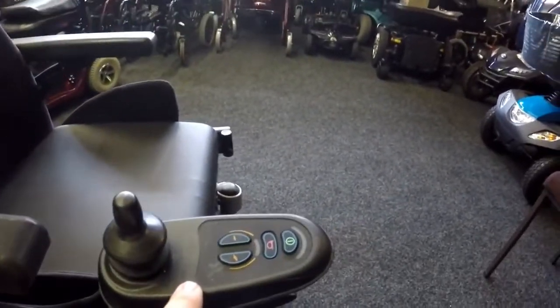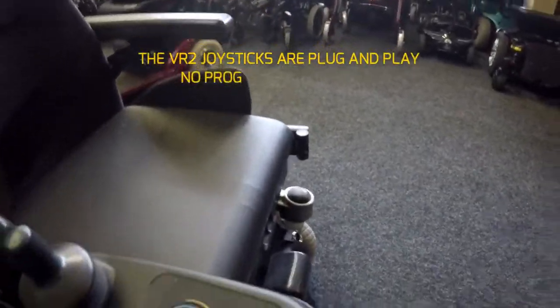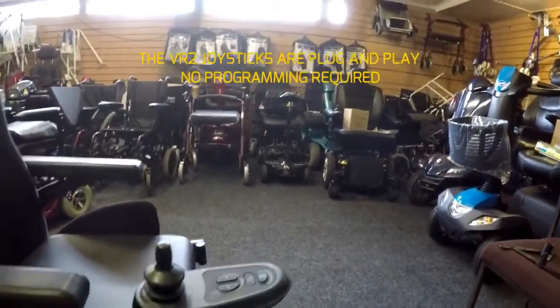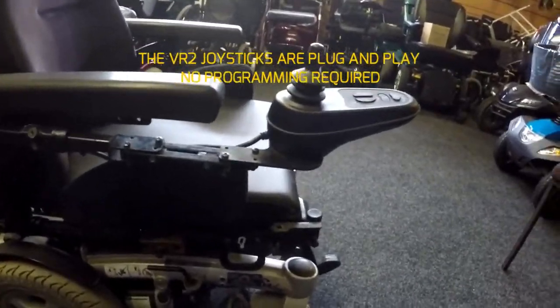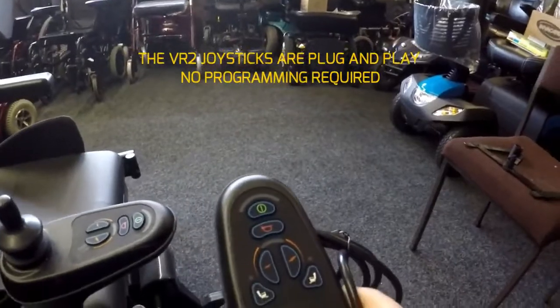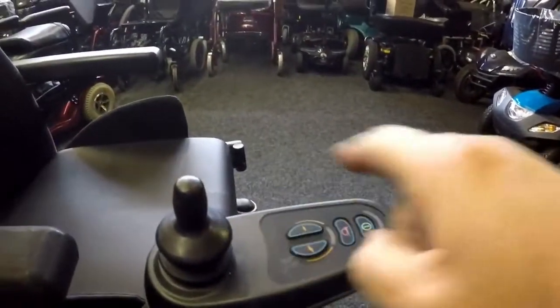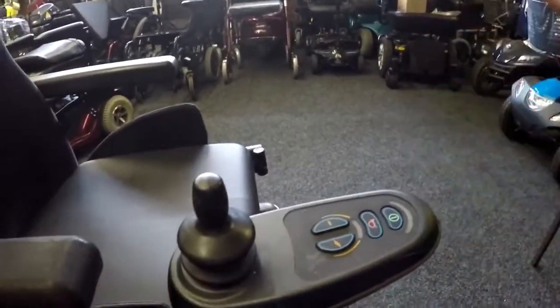I don't actually have that one in stock. Usually I have, but I sold one last week and I'm waiting for one coming. But what I do have is the next one up from that, which is this one here. It has the riser seat tilt function on it. So as long as I get voltage here, I can plug this in and I should be able to see if it's just maybe a faulty touchpad on here.